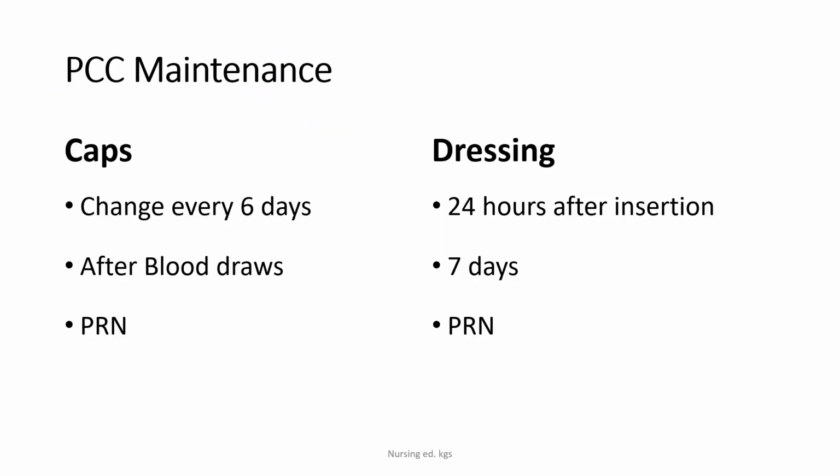For percutaneous central catheter maintenance, the caps are changed every 6 days and after blood draws or as needed. And for dressings, it's changed 24 hours after insertion, then every 7 days. And if it is soiled or loose, of course, you'll be changing it.